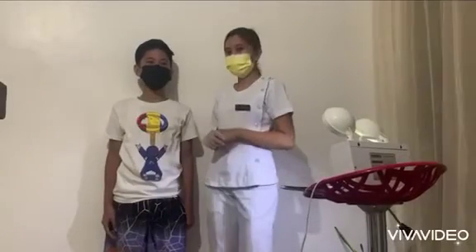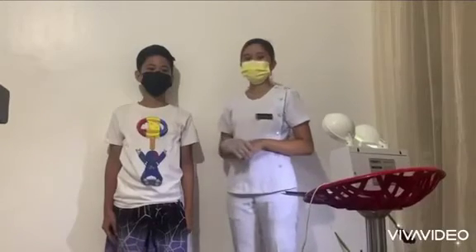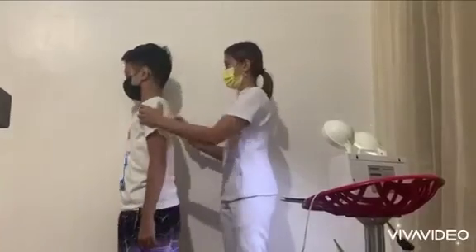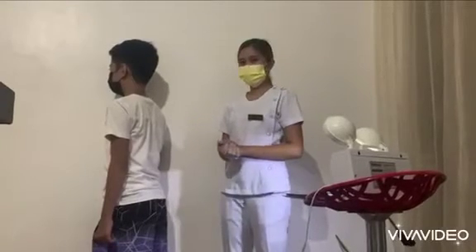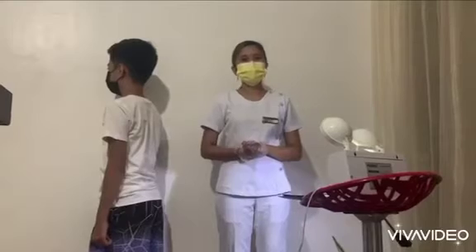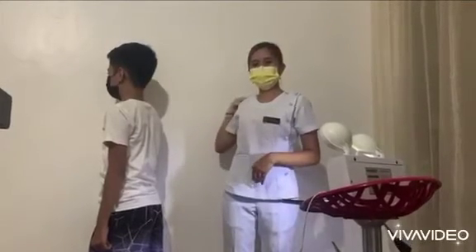Remember that the scapula is not straight across the back, it's angled, right? So what we're trying to do here is look for dislocation. It's very common for people to throw their shoulder out of joint, and that's dislocating the shoulder. The shoulder can dislocate anteriorly or posteriorly.